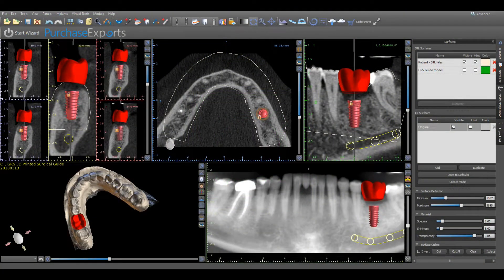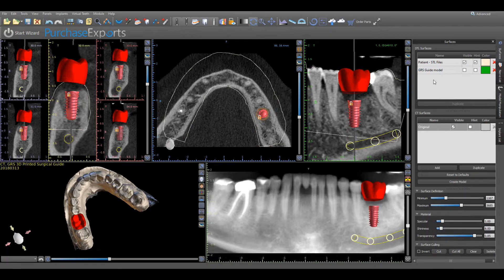Now that all the parameters surrounding virtual implant placement have been established, it's time to design a surgical guide to be 3D printed. Begin by confirming that BlueSkyPlan is set in advanced mode, the uploaded model used to design the case is visible under the STL surface heading, and that the visibility has been turned off for the original scan under CT surfaces.